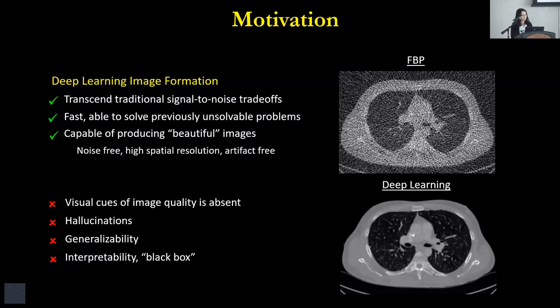There are also concerns with generalizability of these algorithms when applied to data that's outside the distribution of the training data. And a lot of the traditional network architectures are used as black boxes and lack interpretability.